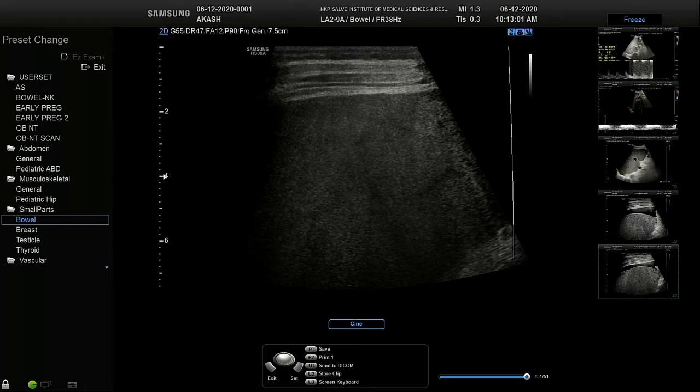We have to write basically what we have seen, and the first patient had only one finding, that was paraumbilical vein, and all literature says presence of paraumbilical vein is pathognomonic of portal hypertension. Patient may not have symptoms. Such patient need to be followed up further on a regular basis.